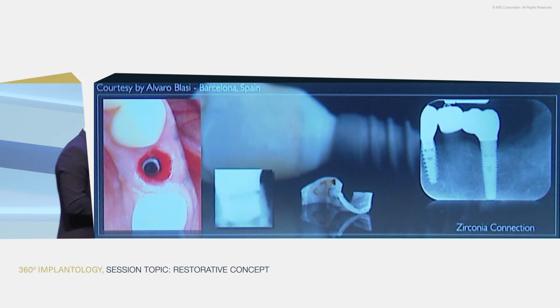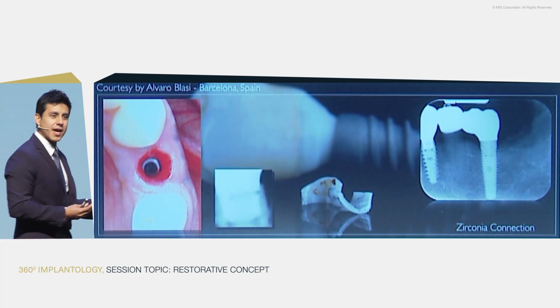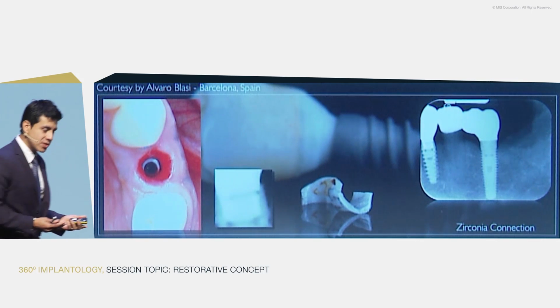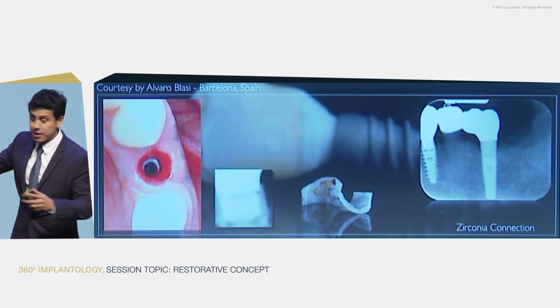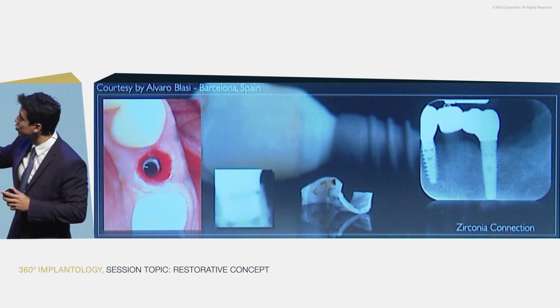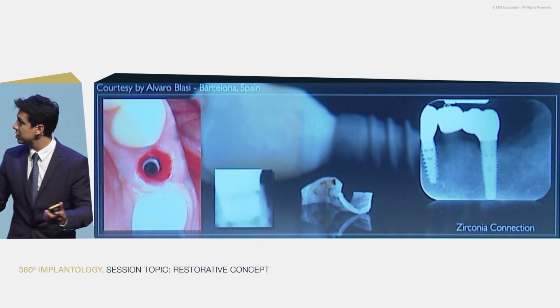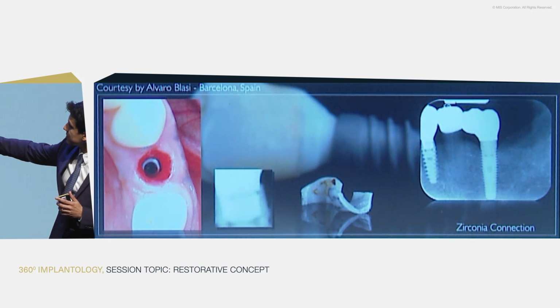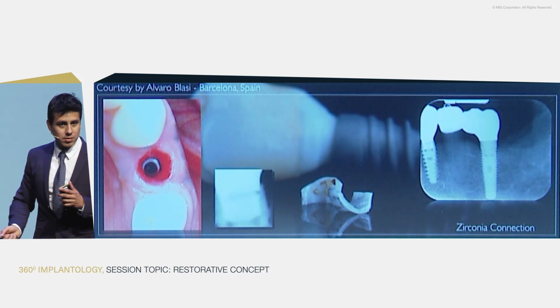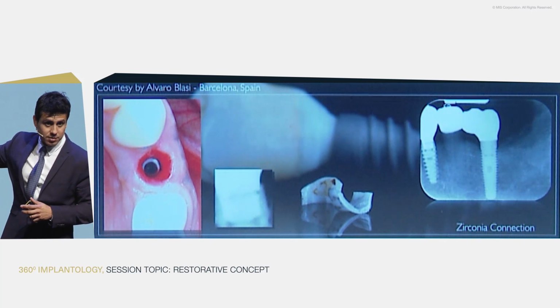Alvaro is a friend who worked with a prosthodontist, with a lot of oral rehabilitation, and he mentioned to me that he had some problems in patients with high function who broke the zirconia abutments. And he mentioned also that it's so difficult to remove this. And sometimes if we do not see that it starts to break, the patient starts to have some wear in the implant area and can have some pigmentation in the tissue, because zirconia with implant can damage the implant, okay?